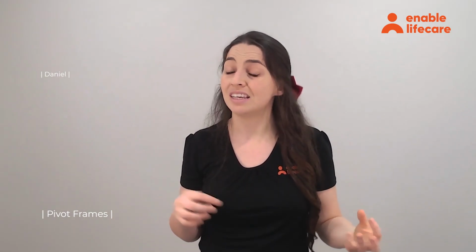So with our pivot frame, we have Daniel. He's a client with cerebral palsy, and he needs very precise postural adjustments. 2 and 4 point, even the 6 point spreader bar didn't really provide enough control or support, and that's why he needed to go with pivot frame.